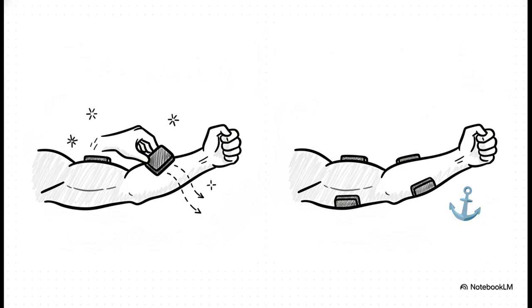The second option is the stabile technique. Here, both pads are completely fixed at either end of the muscle. This stationary setup is much better suited for targeting deeper muscle groups where stroking won't penetrate effectively.